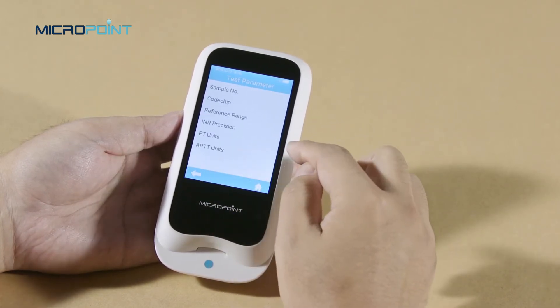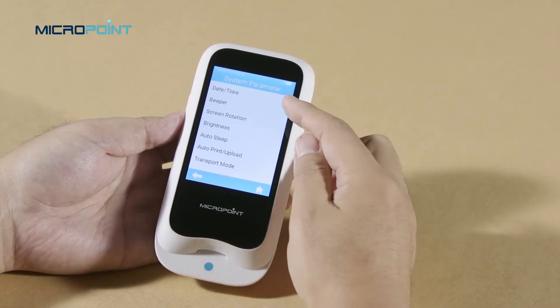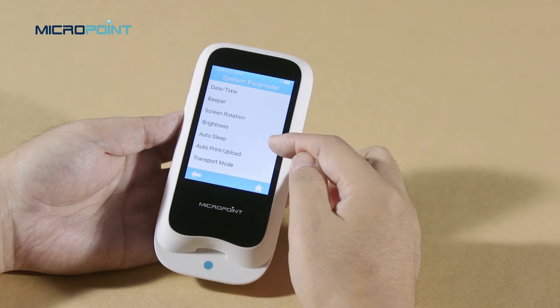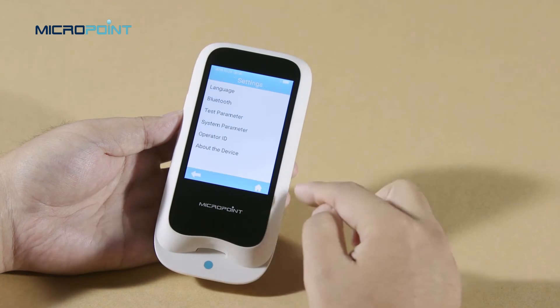In the system parameter, you can change the date and time, set the beeper, screen rotation, brightness, auto sleep, auto print or upload, and transport mode.